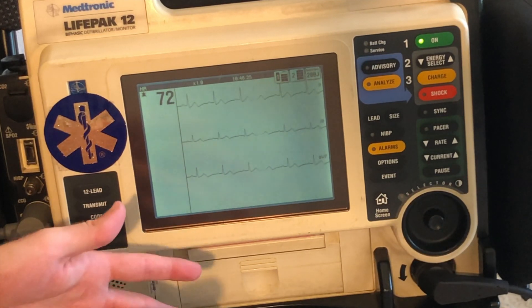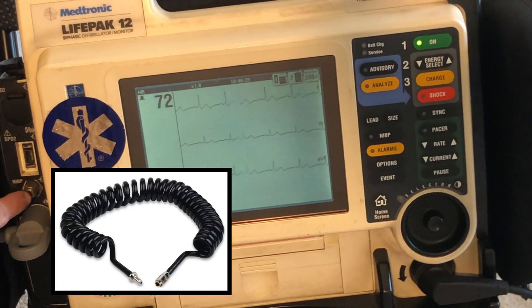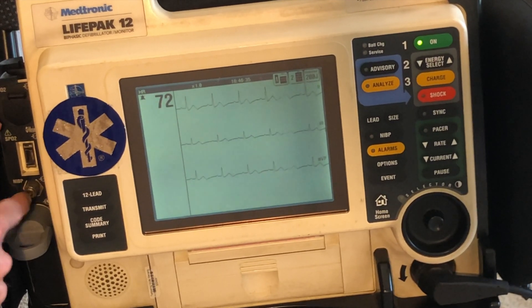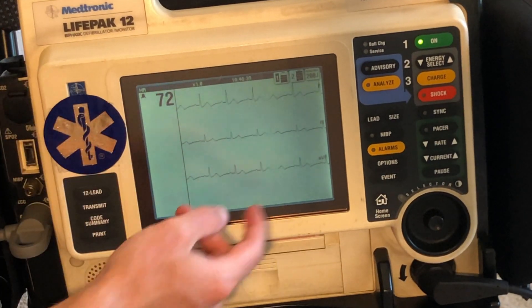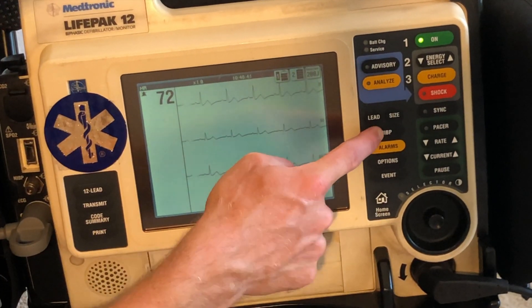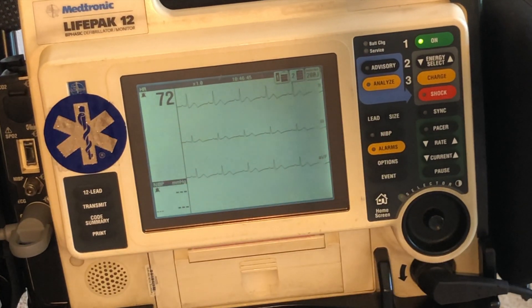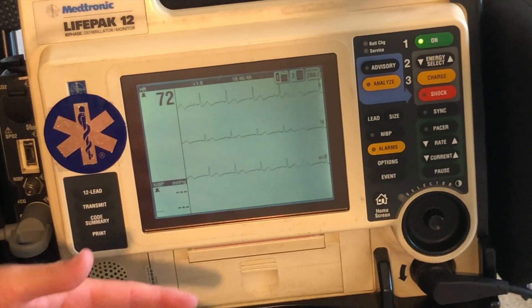Now if you want to do a blood pressure on the patient, you're going to connect your blood pressure tubing into right here — into NIB, non-invasive blood pressure. You put this tube in, place the cuff on the patient, and all you do is hit this button here and it starts doing a blood pressure. It will get its reading, pump up on the patient, and give you a reading.